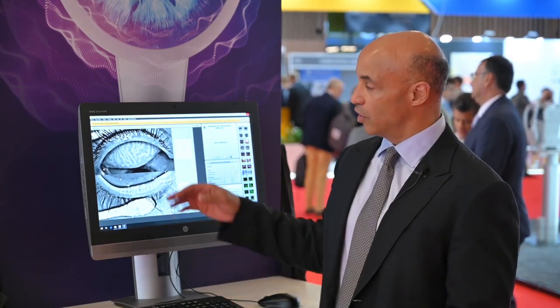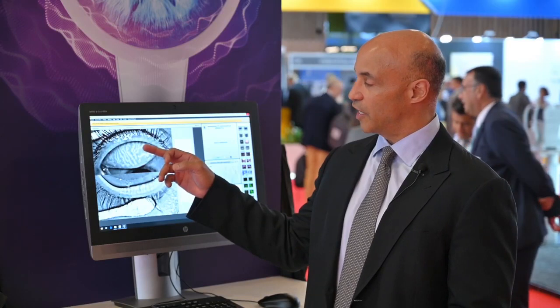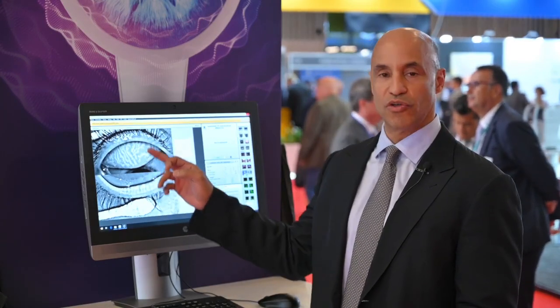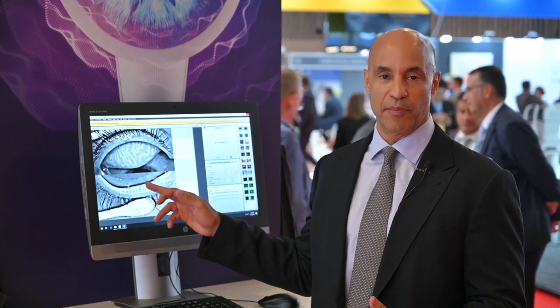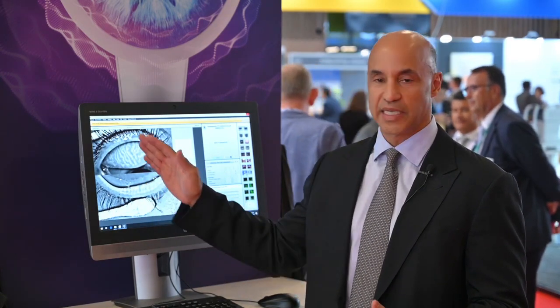One of the good things about the Keratograph 5M is it does give you a wide view of the meibography. For example, when we lift the upper lid, we can actually see all those Meibomian glands. And here are the things that I'm looking for. One is the regularity of the Meibomian gland. It should be a nice straight line, and I'm looking for it not to be so full with a toothpaste-like secretion.